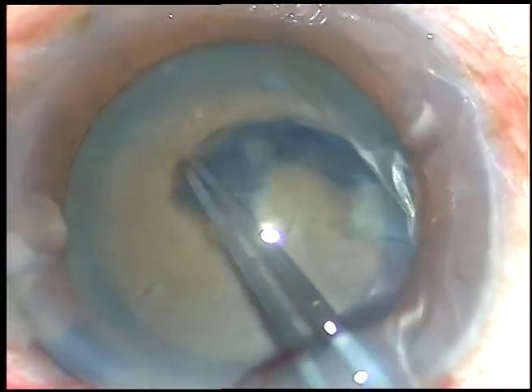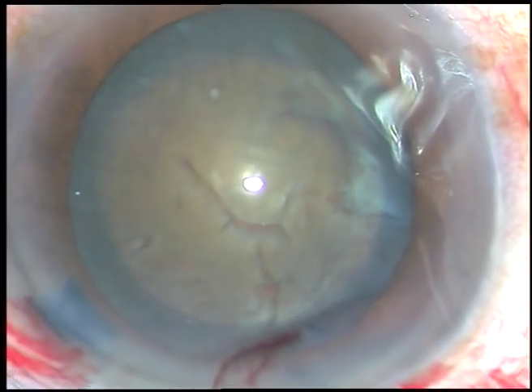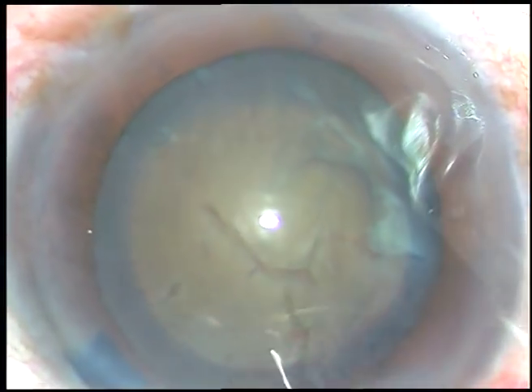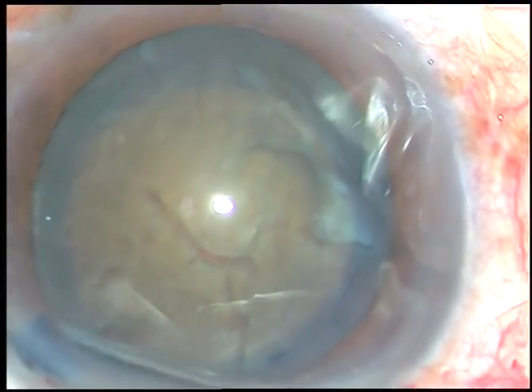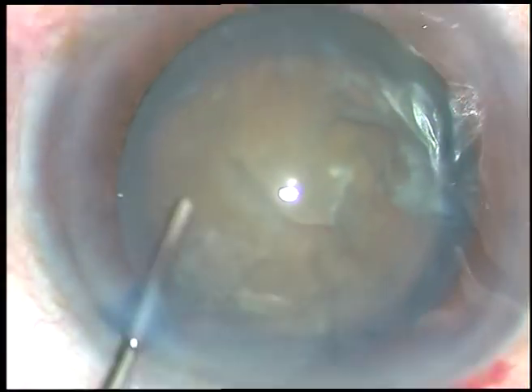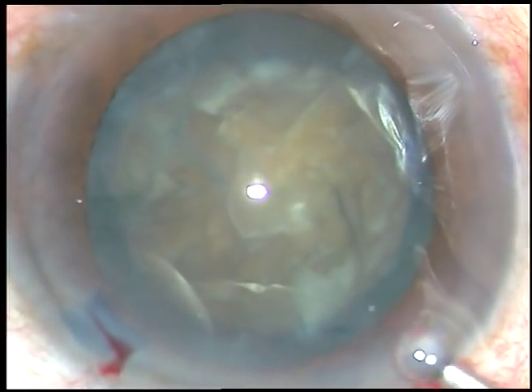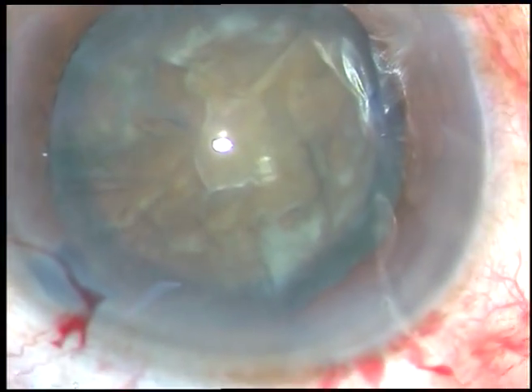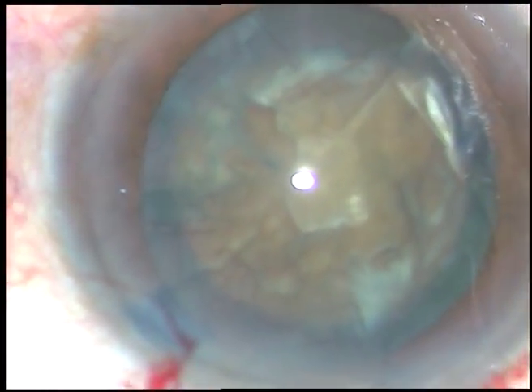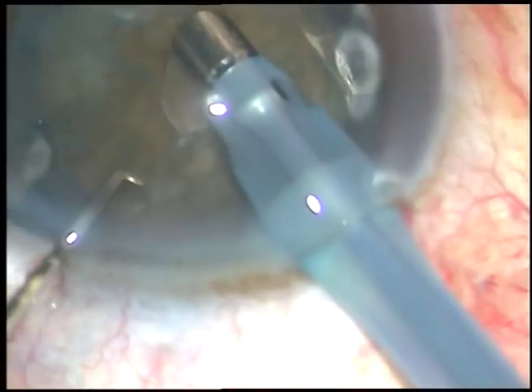Now, if you can raise your skills to such a level that you can do a round rhexis like this in most of your cases, do you really need a femtosecond laser? No, because if you own such costly instruments, you are going to charge your patients. You will not be able to keep your packages economical. It is good if you can have such tools and still make your surgery affordable.